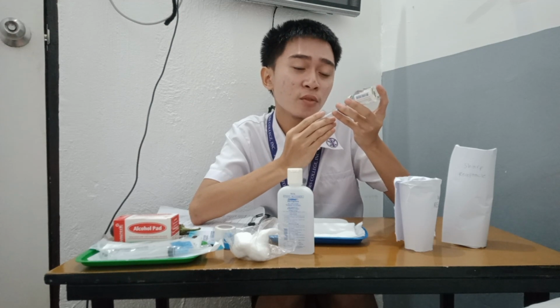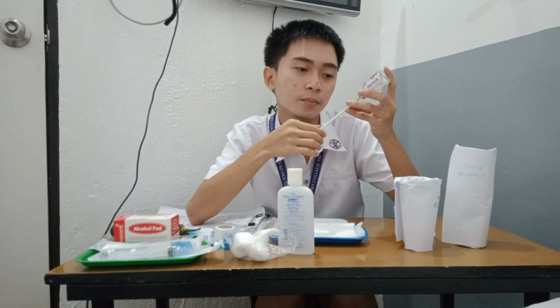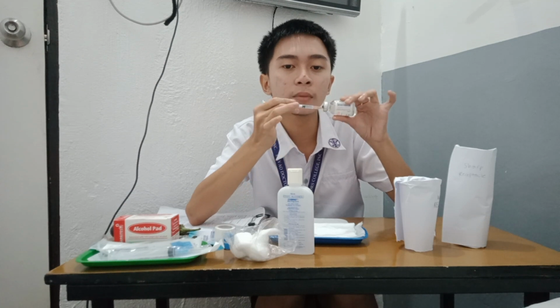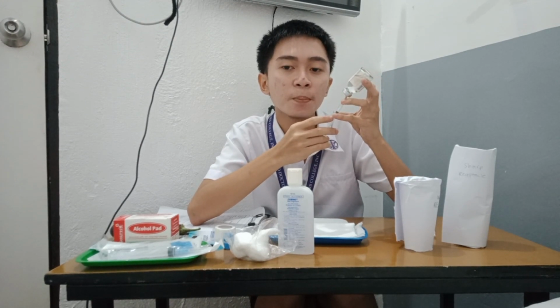So I'm going to invert the vial and draw the exact amount of medication needed. After doing that, if you see an air bubble inside the syringe, then you can lightly tap the barrel to expel the air bubble.